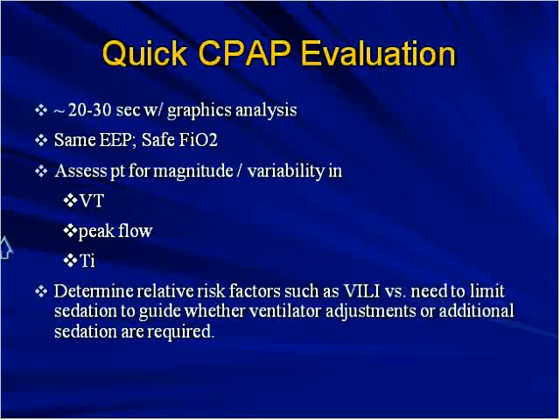If someone is pulling a tidal volume or a flow rate greater than what's set on the ventilator once every 6 or 7 breaths, in that range, I wouldn't worry too much about changing your vent settings. But obviously, if every breath is outstripping what we have on the ventilator, we have to make some decisions. And the decisions come down to 2 aspects. Number 1, what are the relative risks of ventilator-induced lung injury in this patient versus what is the need to limit sedation?